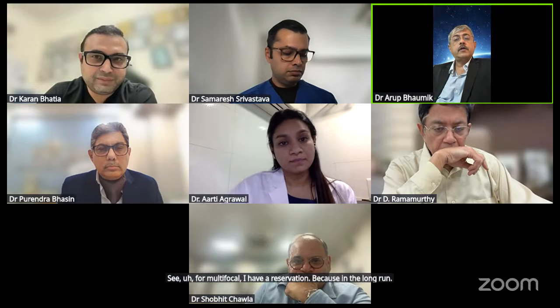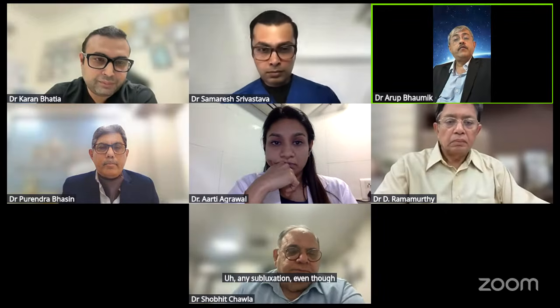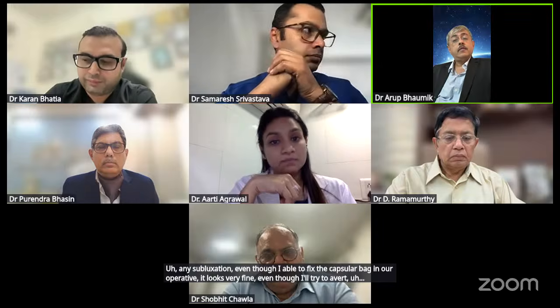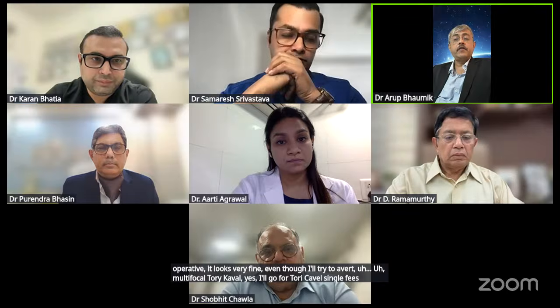See, for multifocal, I have a reservation because in the long run there is some kind of contracture and a slight decentration of the lens. Then it will be really problematic for the patient. So I will definitely avoid any kind of multifocal if there is any subluxation, even if I am able to fix the capsular bag intraoperatively and it looks very fine. Toric IOL, yes, I'll go for a toric single piece if I can fix the IOL.